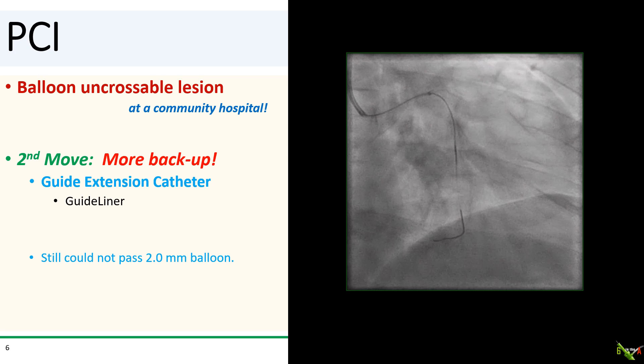My second usual move is to improve my backup. My threshold for using a guideliner is very low. But despite the guideliner in place and advanced deep into the vessel, nearly to the lesion, I still could not get either a 1.5 or 2.0 mm balloon to cross. You see here that the guideliner and guide are both getting kicked back.